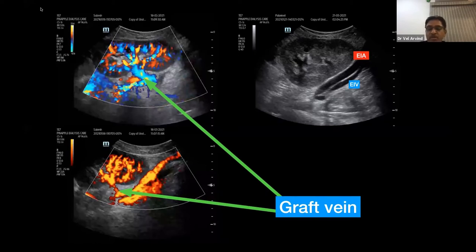If the patient is cooperative but has an obese abdomen, it's difficult. If it's a very thin abdomen, it's very quick. Within a few seconds you can catch it, especially when a patient comes in post-transplant with uncontrolled blood pressure and you suspect transplant renal artery stenosis, which is quite uncommon in modern days. So surgeons are doing a quite good job.